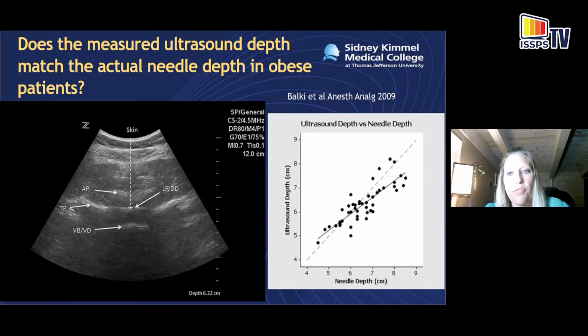So you have to account for that. And the literature varies as far as how much compression you might have to account for. It can be 1 centimeter or even slightly more. So it's just important, when you are trying to measure the depth to the dura or the posterior complex, and as far as your neuraxial structures, to note that the ultrasound depth is not going to be completely accurate. It will likely be a different depth.